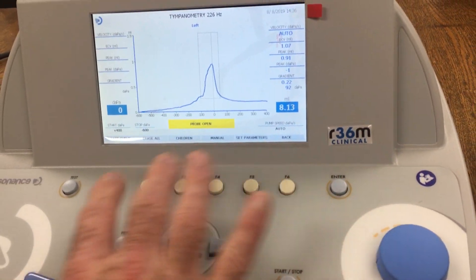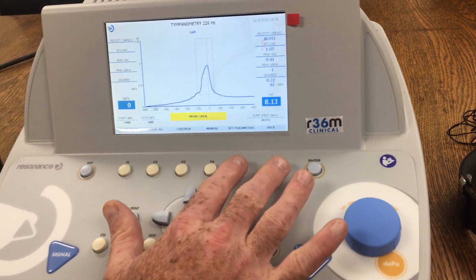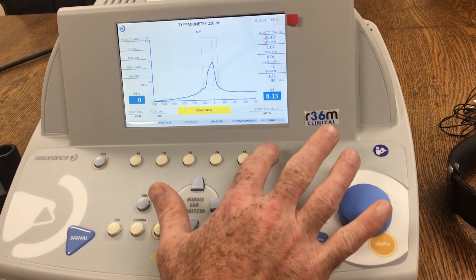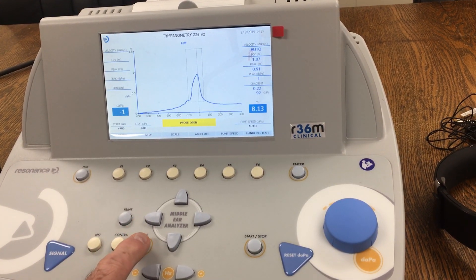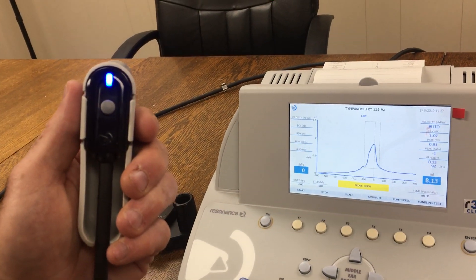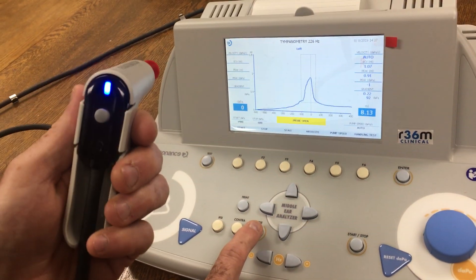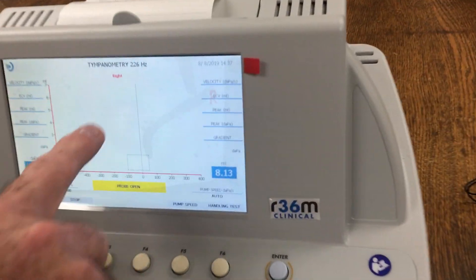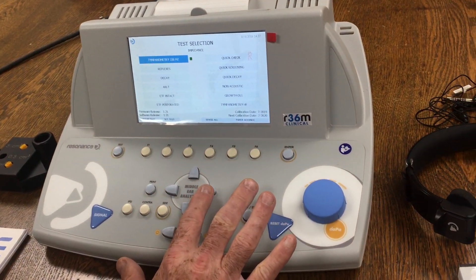At this point you can erase the curve, erase all the tests, or set the parameters. When you switch sides, by hitting the button it will change the color depending on what side you're on, corresponding with right or left. Let's go over to the quick check test — that's one of my favorite ones.